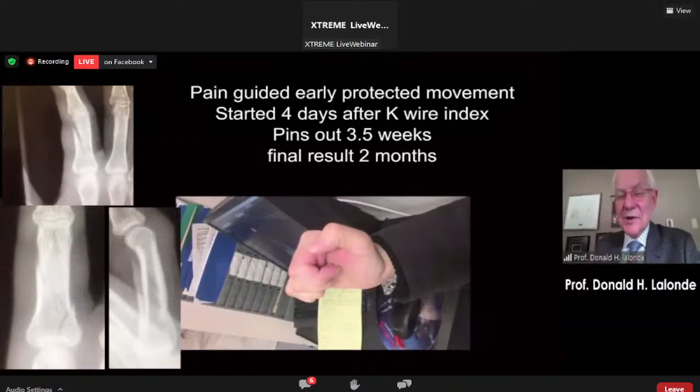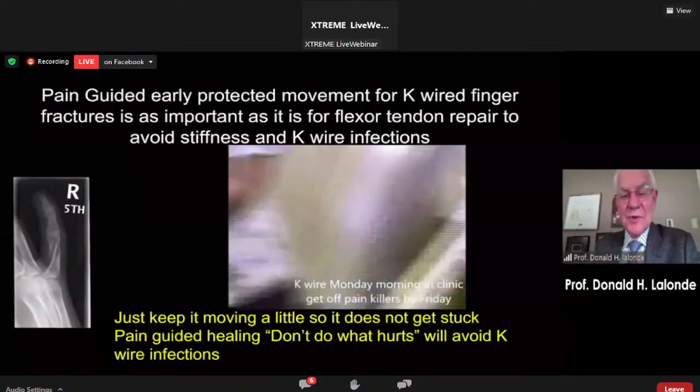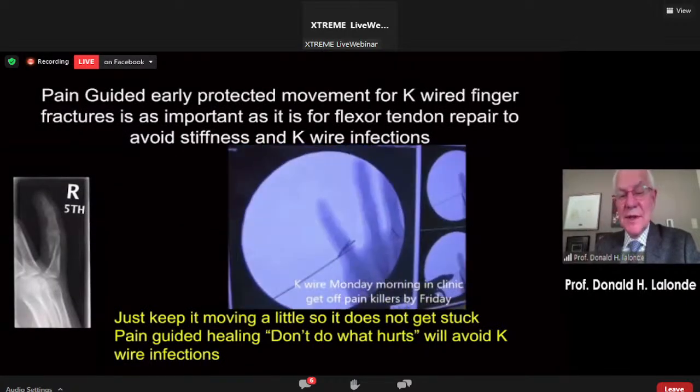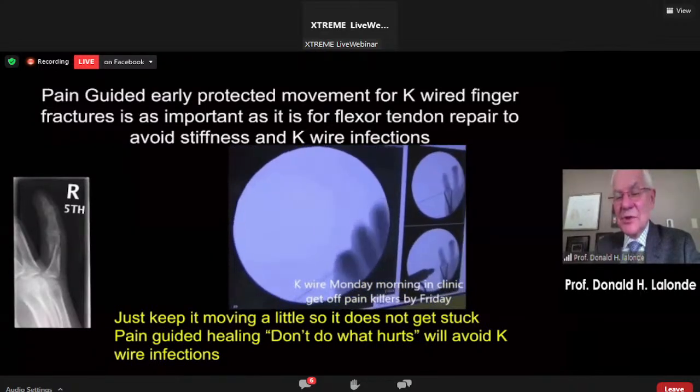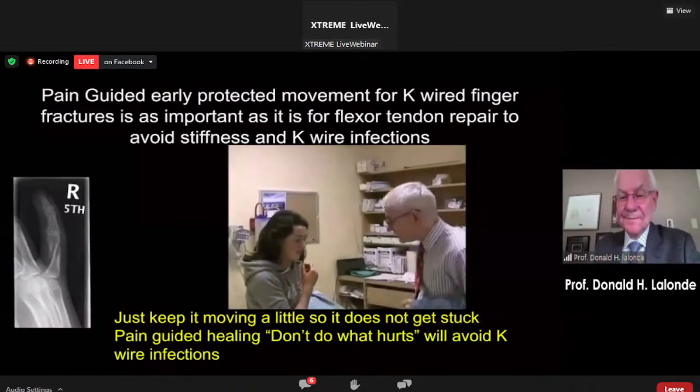I could show you 100 of these. I'll just show you a couple more though, because I think it's important. And in this case, I put in a third K-wire because after two K-wires, it moves. Just like that, no walking around like that.